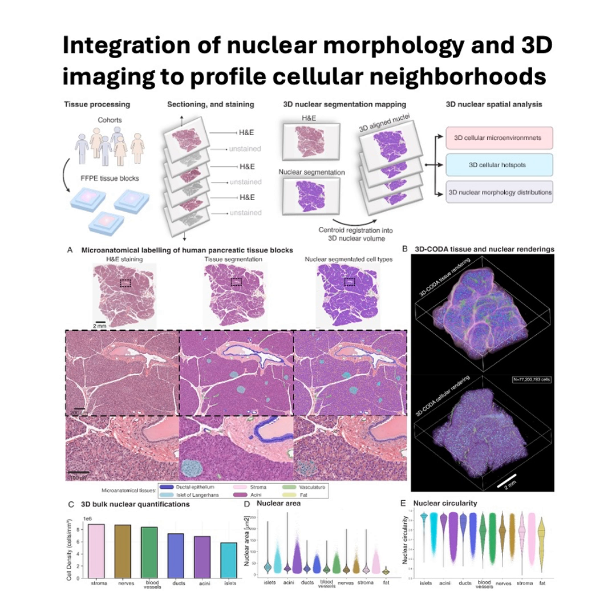Context. Okay, so that maps out the major structures, the neighborhoods in our city analogy, but what about the individual residents, the cells? How do they identify every single nucleus? That seems crucial. Absolutely critical. For the nuclear segmentation at the cell level, they use a fine-tuned AI model called StarDist. It's known for being good at finding nucleus-like shapes. They originally developed it for even higher magnification images, but they carefully adapted and optimized it for their 20x whole slide images. And did it work well?